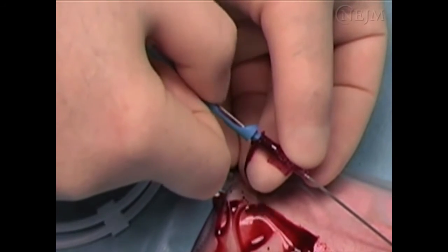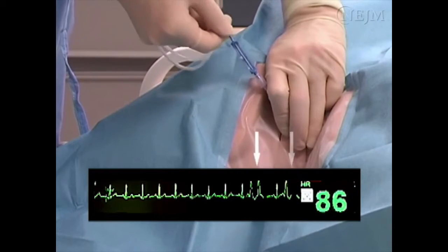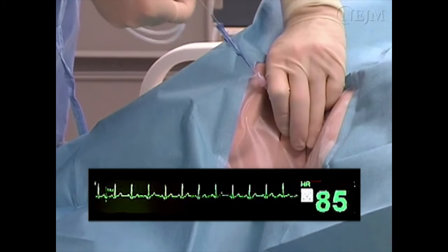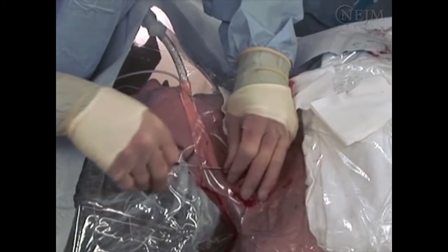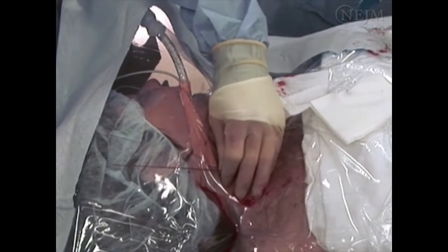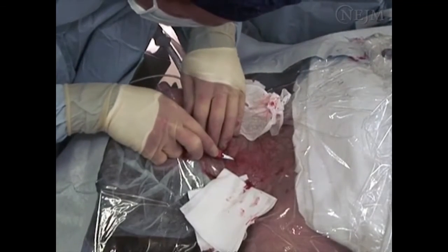An assistant should watch the monitor, looking for signs of arrhythmia during advancement of the guide wire. Arrhythmias indicate that the wire has reached the heart. If arrhythmias occur, withdraw the wire slightly until they cease. After the guide wire has been inserted, withdraw the needle, leaving the guide wire in place. As the needle exits the skin, be sure to grasp the guide wire at the skin. At this point, only the wire remains in place.